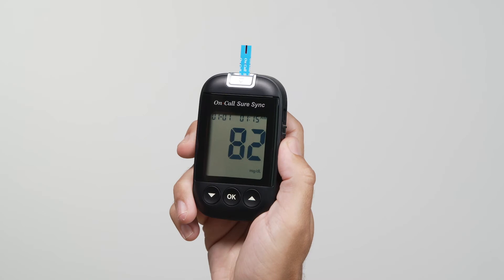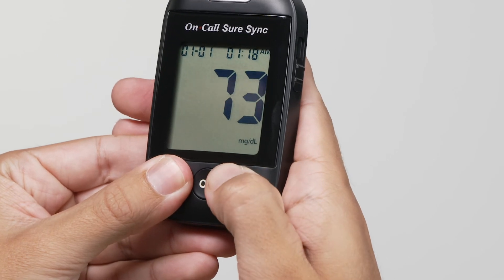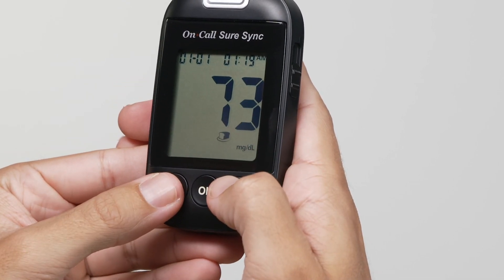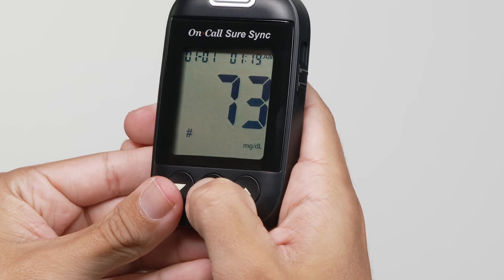Blood glucose results are automatically stored in the memory. To erase a reading, press the down and up buttons together. When a pound sign appears on the display, press the OK button. A pound sign means that the result will not be included when calculating the 7, 14, 30, 60, and 90 day averages.